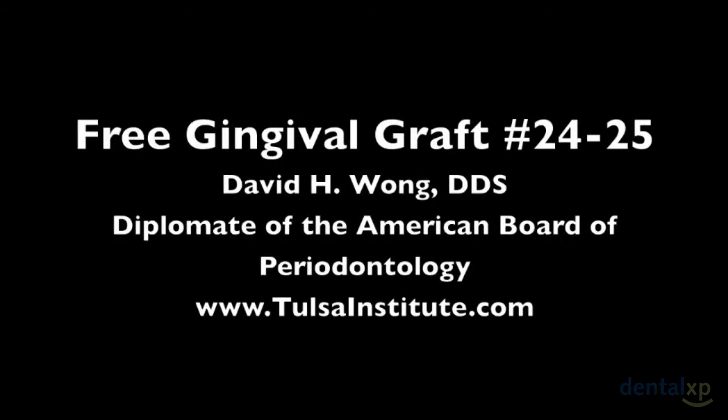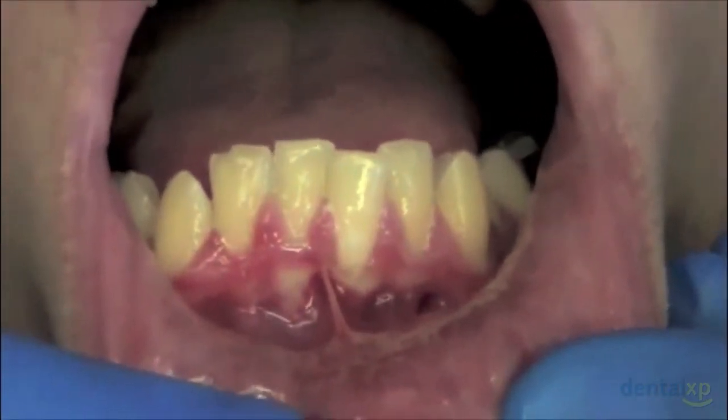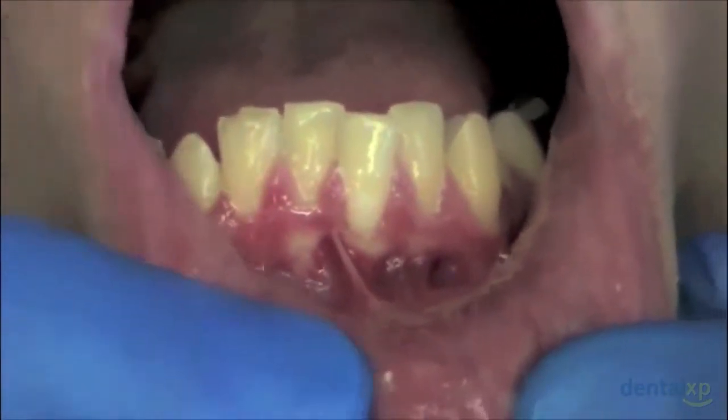Hi, Dr. David Wong here, and today I want to demonstrate one of the more basic periodontal procedures, the classic free gingival graft.